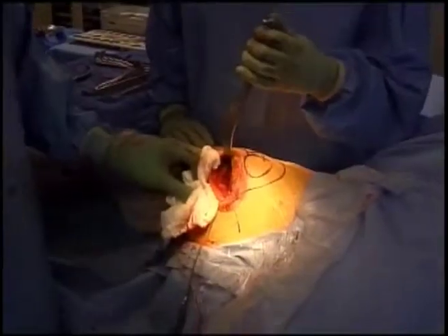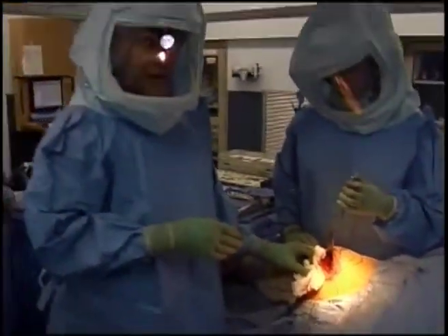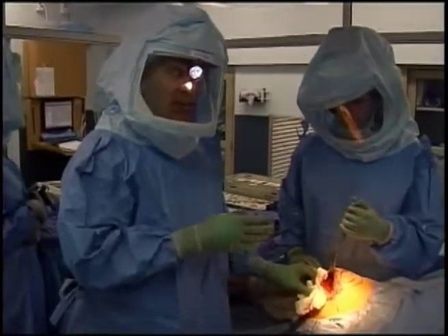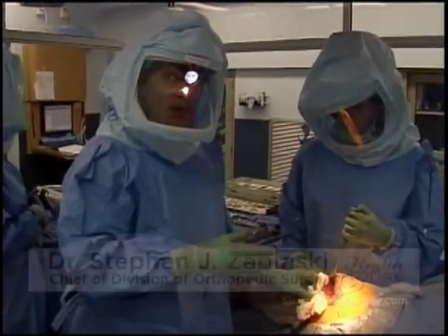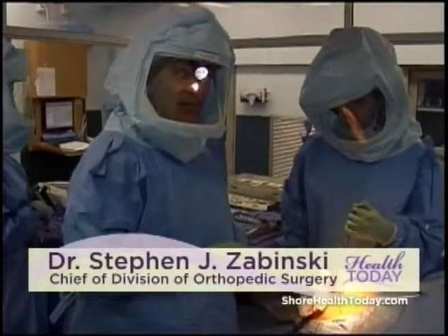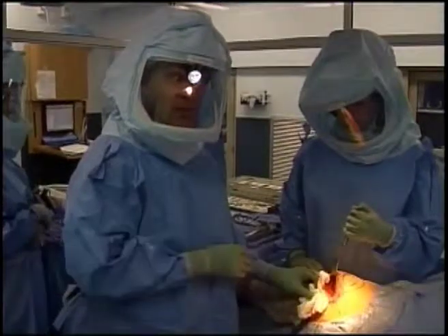We'll now begin to close the patient's wound and bring him to the recovery room. Physical therapists will probably see him this afternoon, get him up out of bed, and begin him walking. He can put full weight on this leg. Thanks very much for your attention — I hope you enjoyed the surgery.